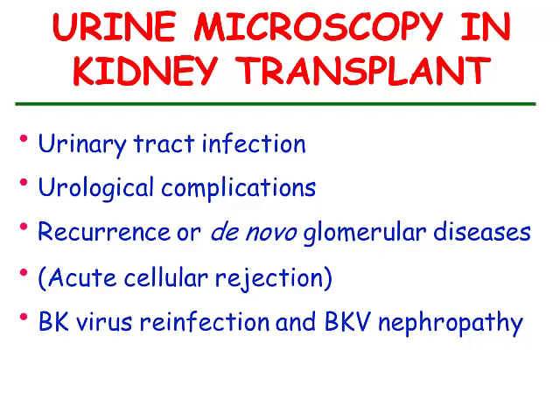Until a few years ago, it was also said that you could make a diagnosis of acute cellular rejection by urine sediment examination when you could find the presence of lymphocytes in the urine. But of course, the diagnosis of acute cellular rejection is a very important diagnosis, and you cannot only rely on urine microscopy. Renal biopsy is the state of the art for diagnosing this condition.